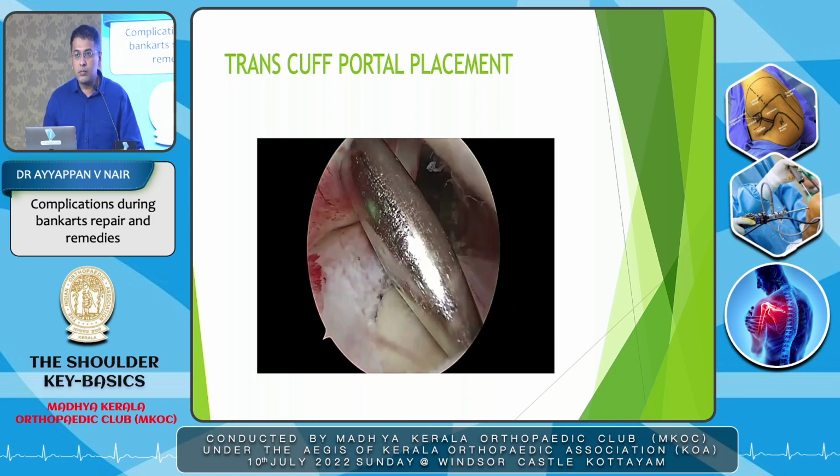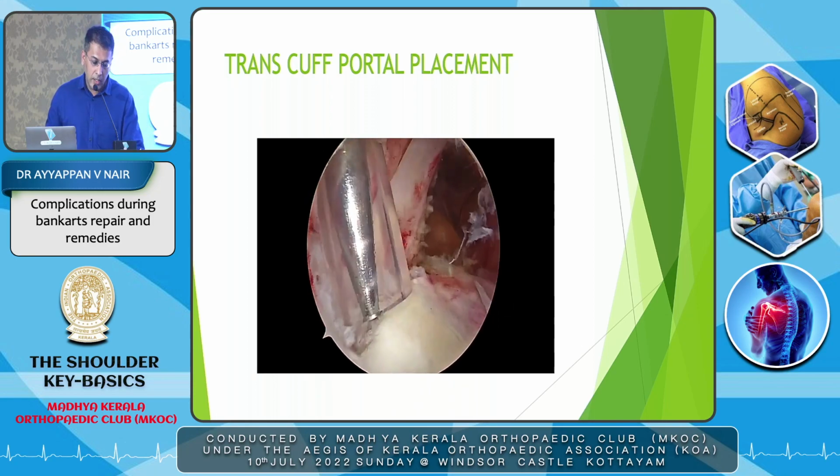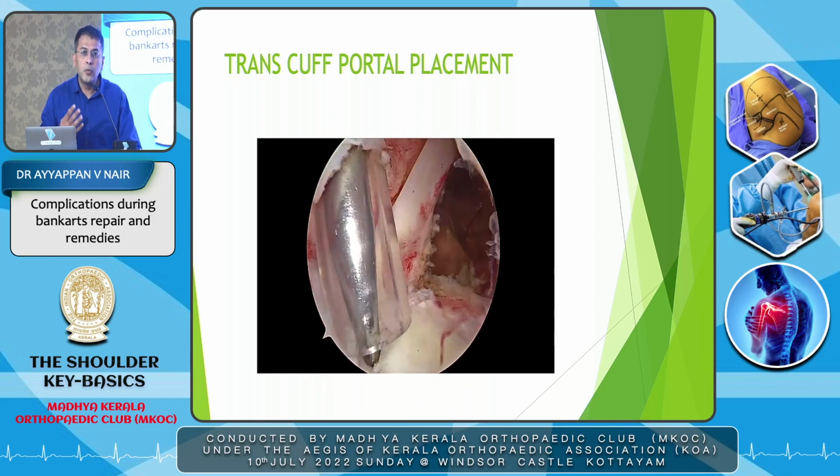Before I go into the next step in more detail, another most common problem we find is that once we are inside, maybe it starts bleeding. How do we manage this bleeding? We can't see inside. Suppose I'm here now, already visualizing, and for some reason the pump has stopped, the fluid has stopped flowing, and then it starts bleeding inside.